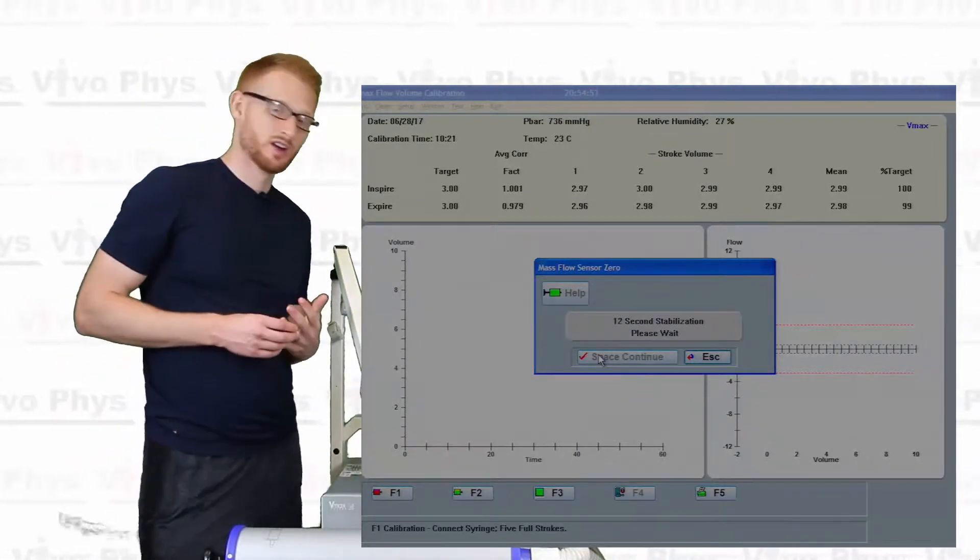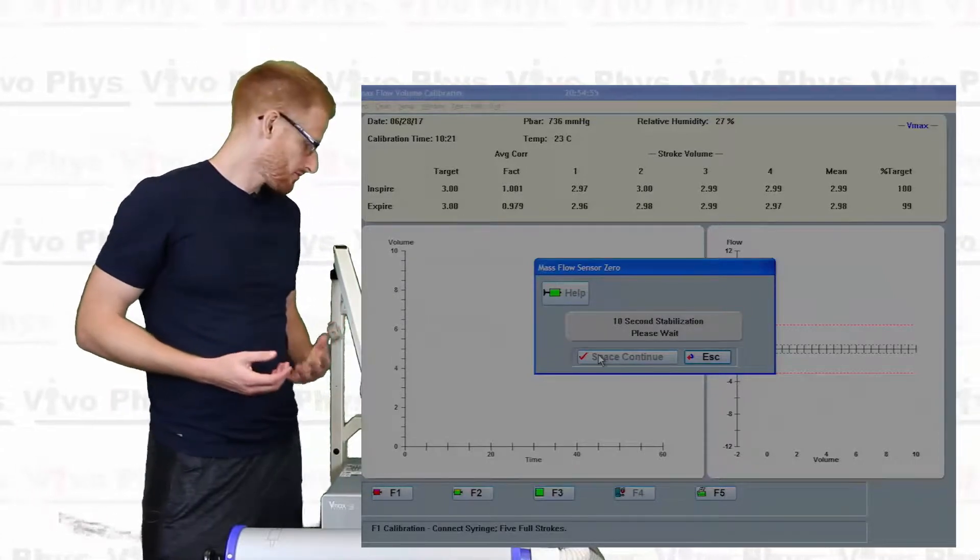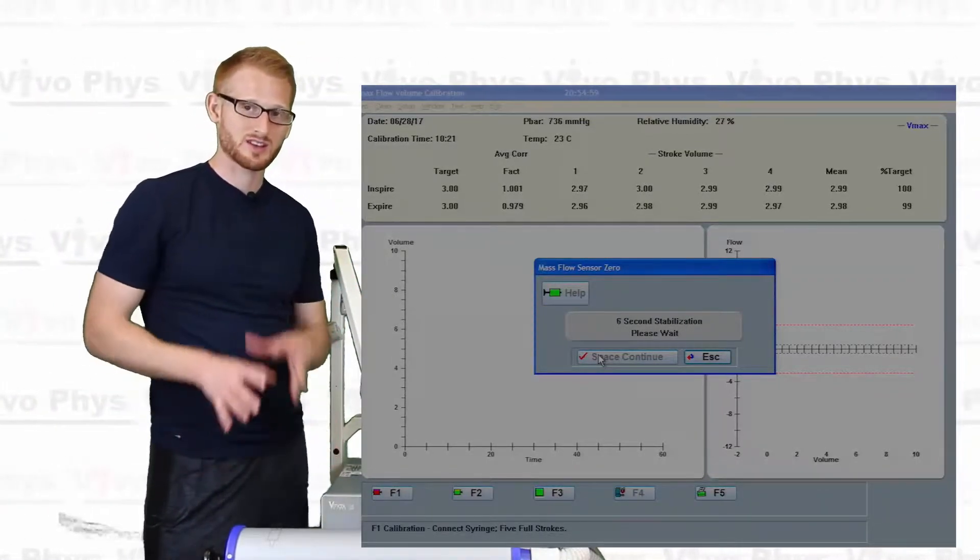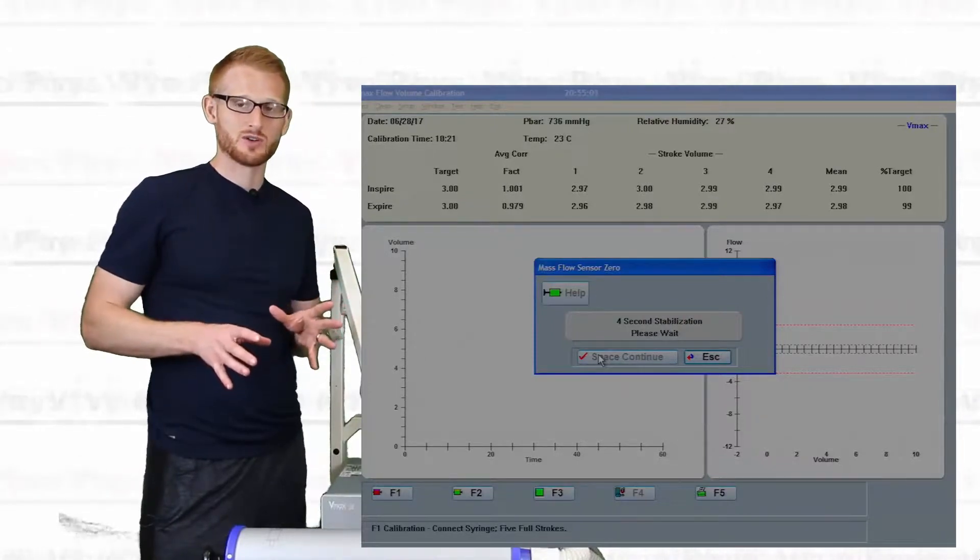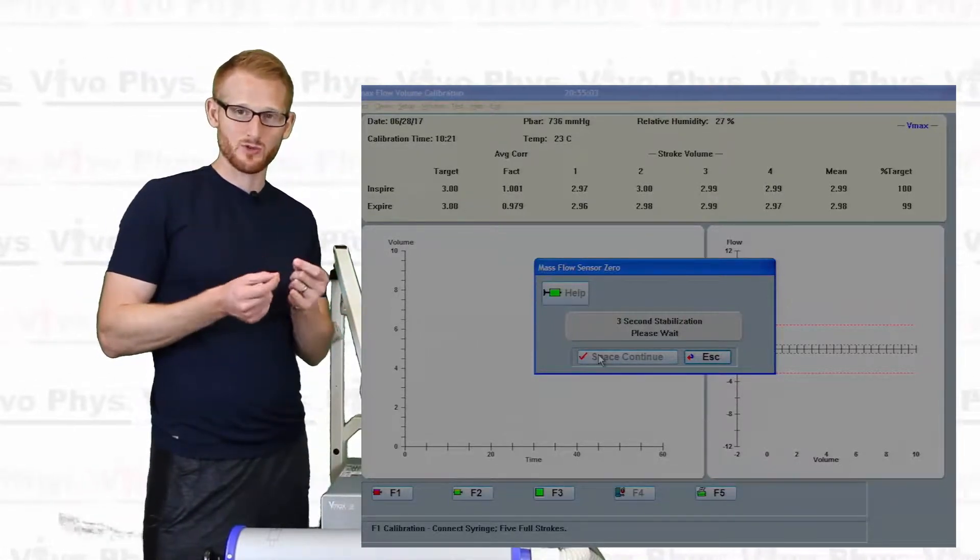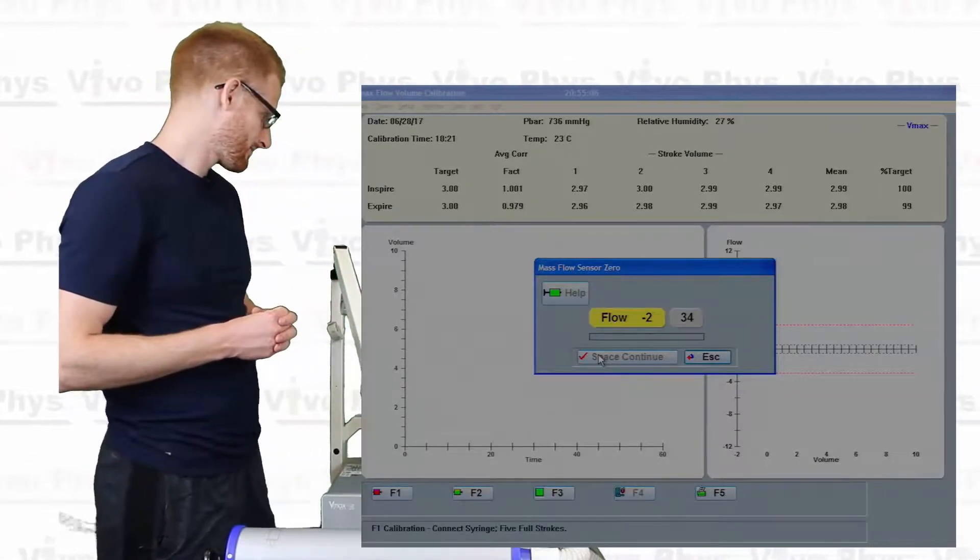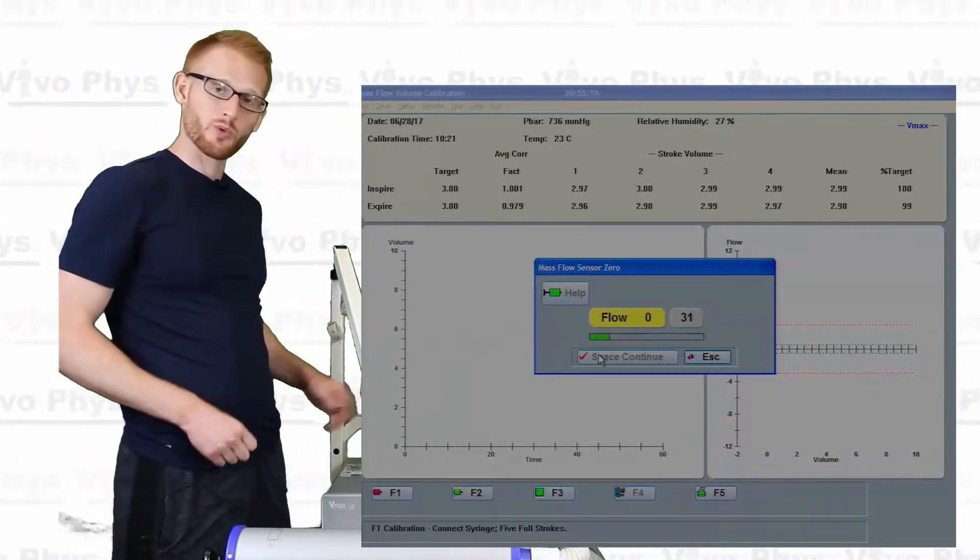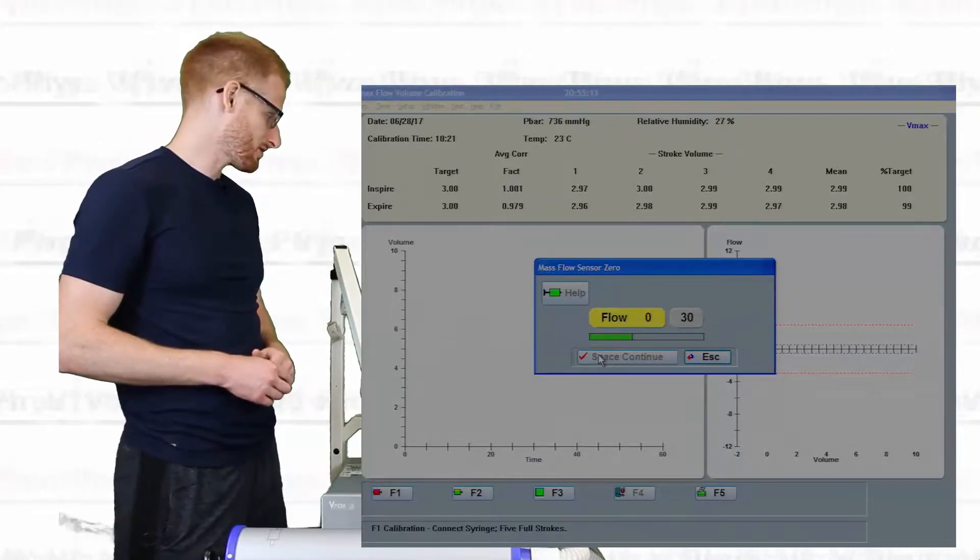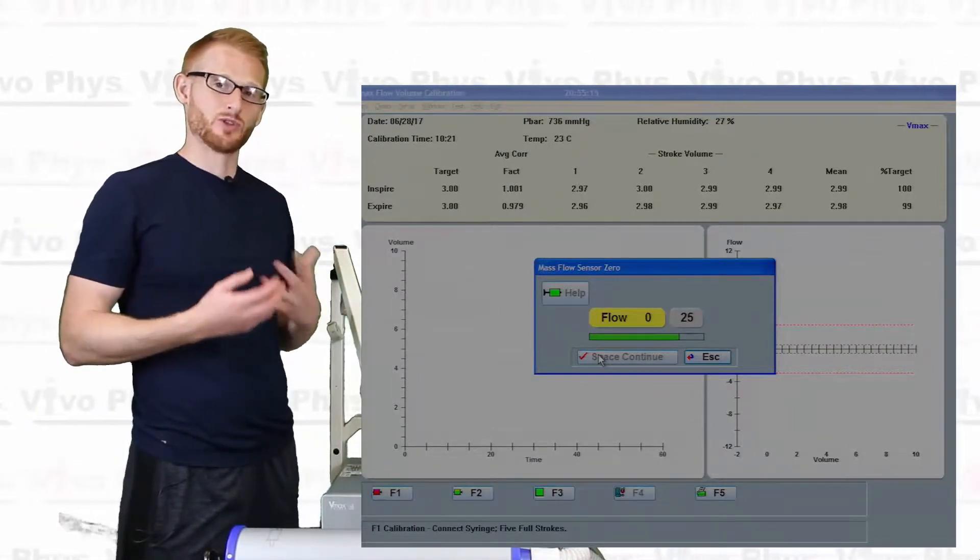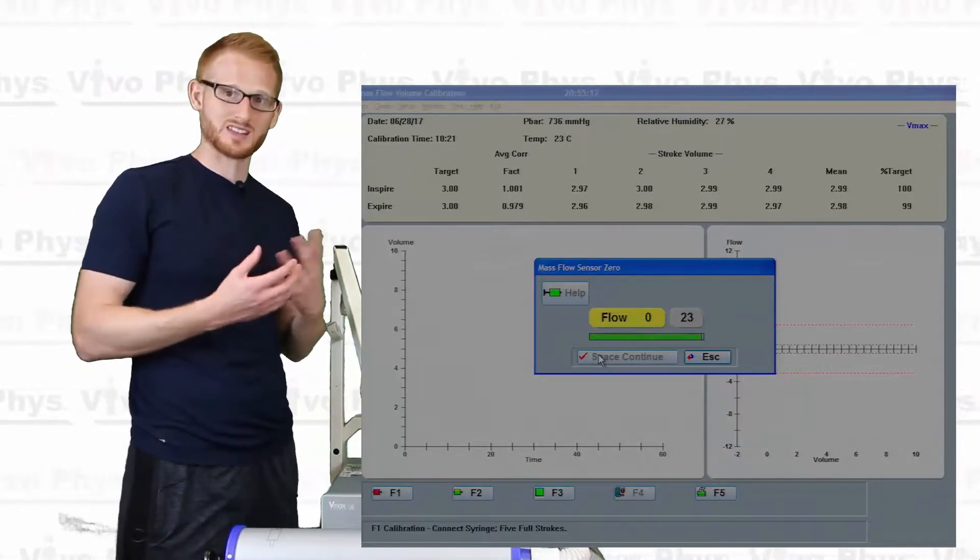Alright, so now it's looking for a period of zero flow. Alright, so we don't want to touch anything. We don't want to move the syringe at this point because anything that we're going to do is going to cause a little bit of air movement in the system. And it's not going to be zero flow anymore.